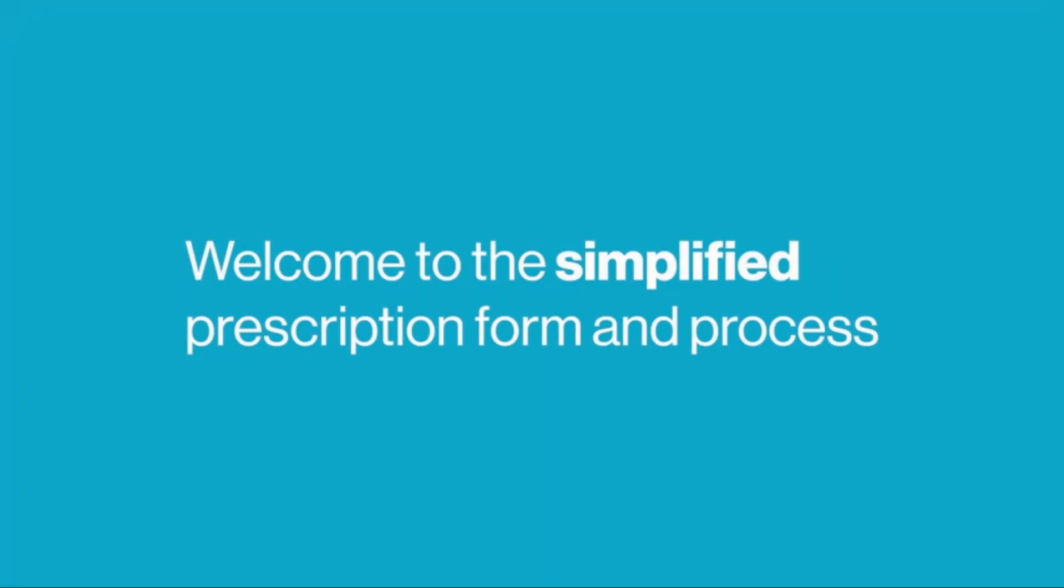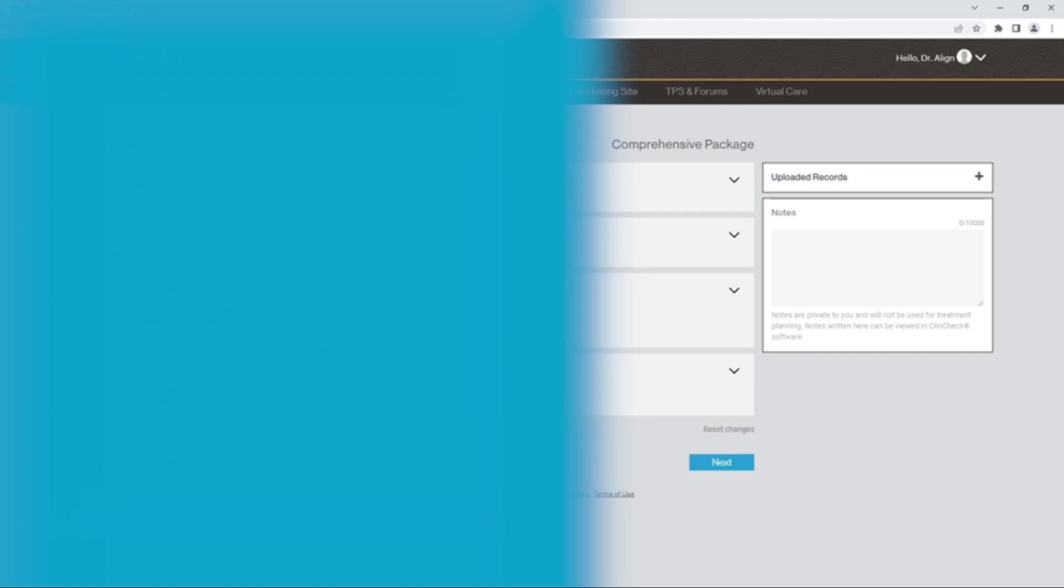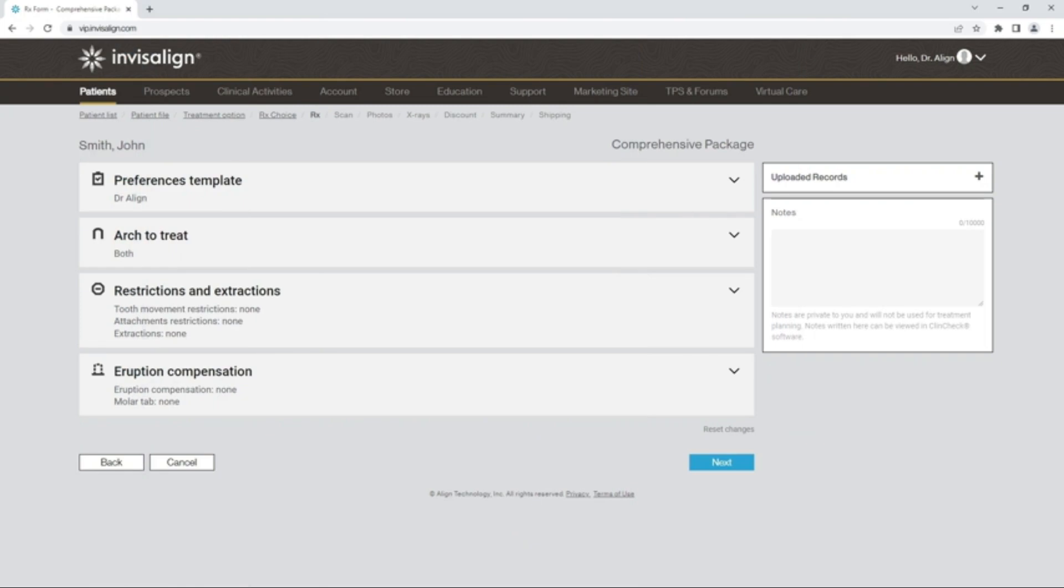Hello and welcome to the simplified Invisalign prescription process. In this video, you will learn how to submit cases and save time with the redesigned one-page FlexRx prescription form.